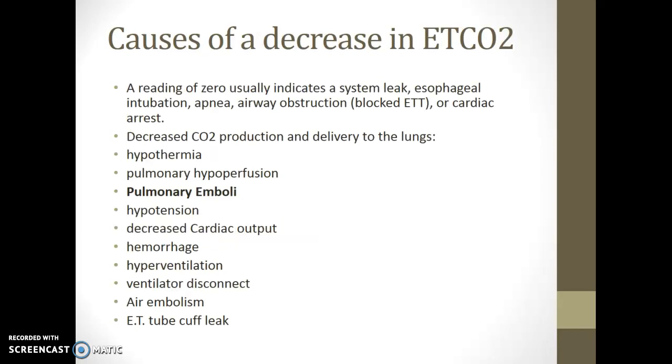Some causes of a decrease in end-tidal CO2. A reading of 0 usually indicates that you either have a system leak, esophageal intubation. If you're intubated in the esophagus, you're not going to get any carbon dioxide returned back to the monitor. If the patient is apneic, same thing. They will not have any carbon dioxide going back to the monitor. An airway obstruction, such as a blocked endotracheal tube, or cardiac arrest. In all of those cases, you're probably going to see a 0 reading because you're not getting any carbon dioxide going back into the monitor.